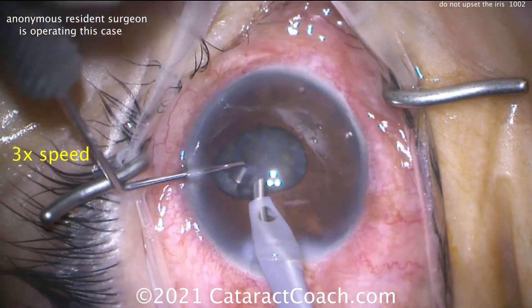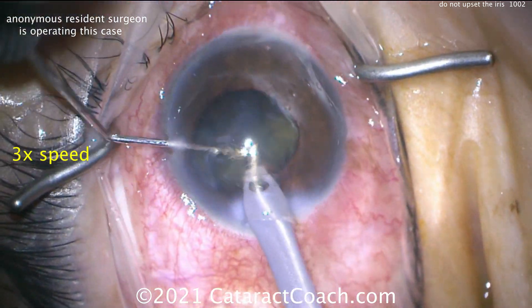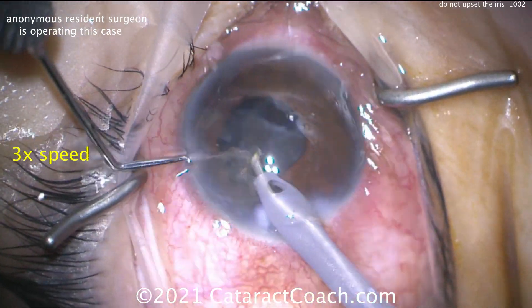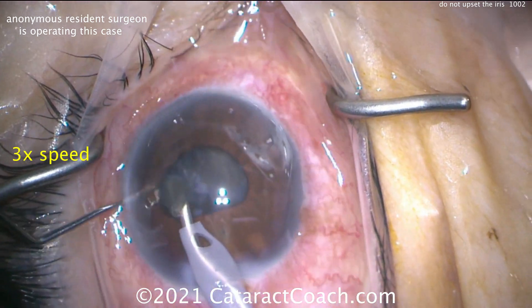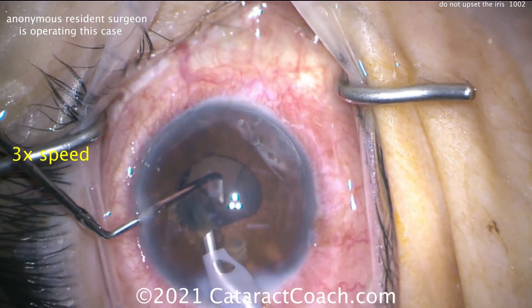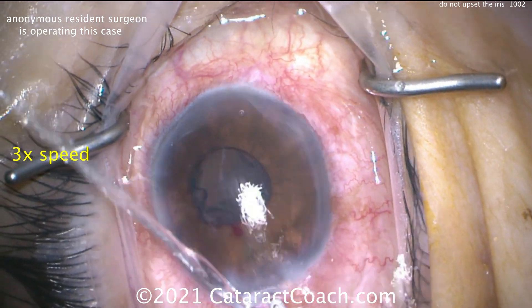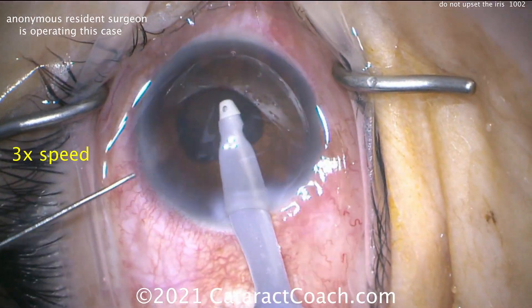Could you put in some iris hooks right now or a pupil expansion ring? Sure, you can — anything you want. But it's not going to be easy, so I think a better maneuver is what's happening here: just get the nucleus out of the bag, get the nucleus up to the iris plane. Keep that tip occluded with nuclear material and just get this cataract gone. Let's just do this — let's get out of this town. Take out the rest of that cataract. Just some cortex left now — we're talking. You can see where that subincisional iris was touched — there's a little bit of bleeding at the pupil margin. Not a big deal, we'll leave it alone.